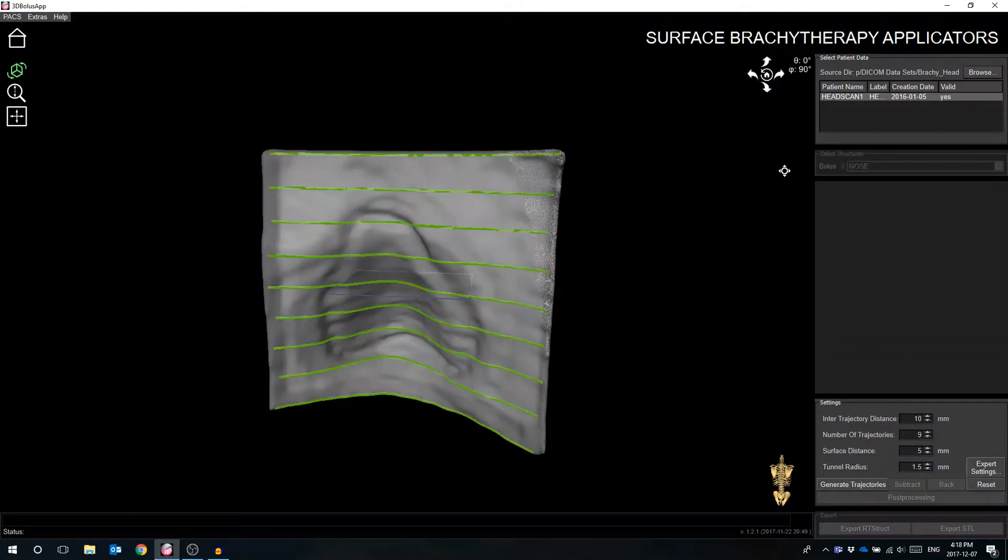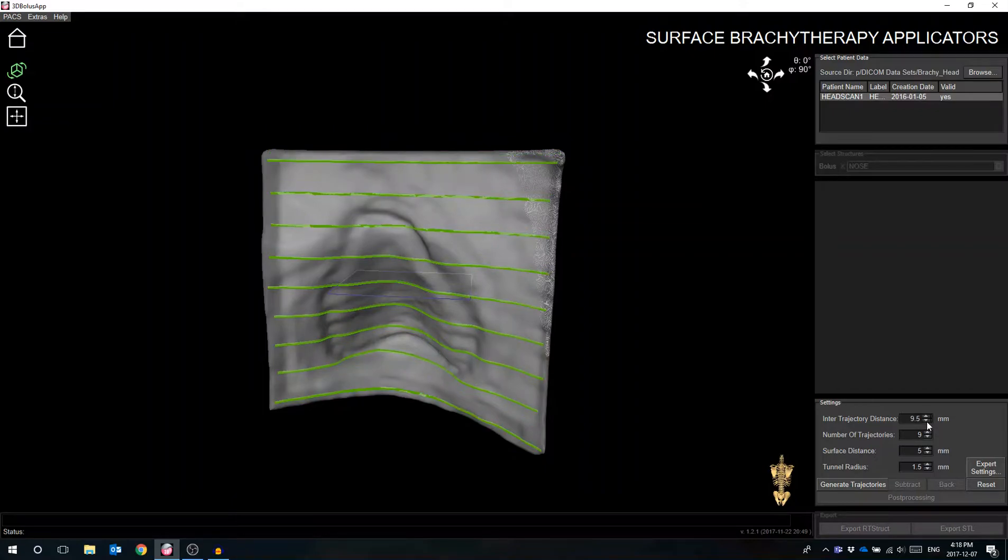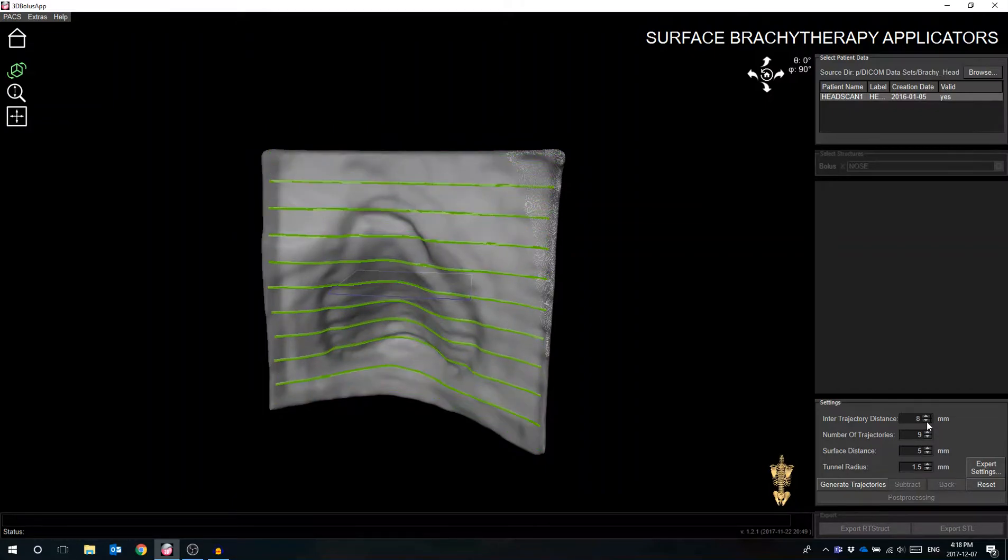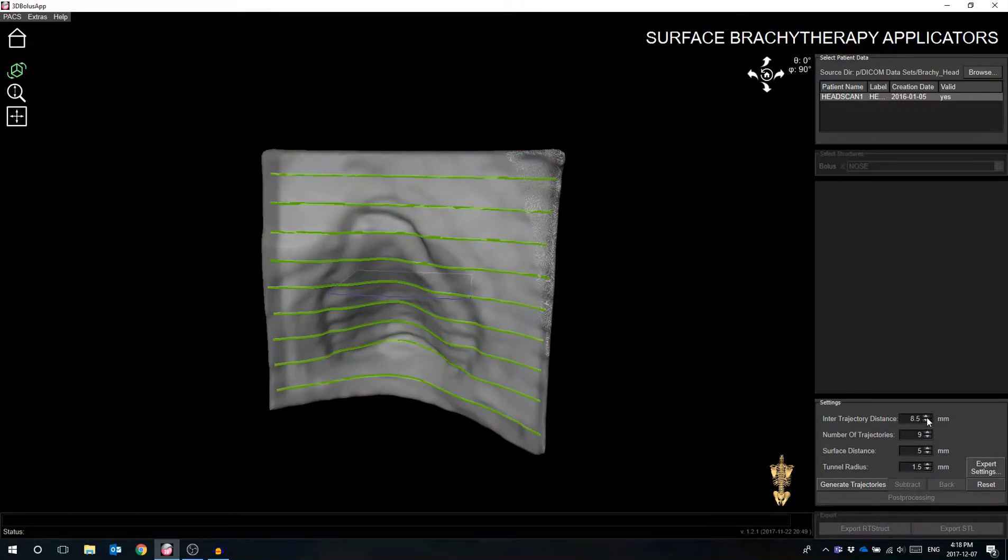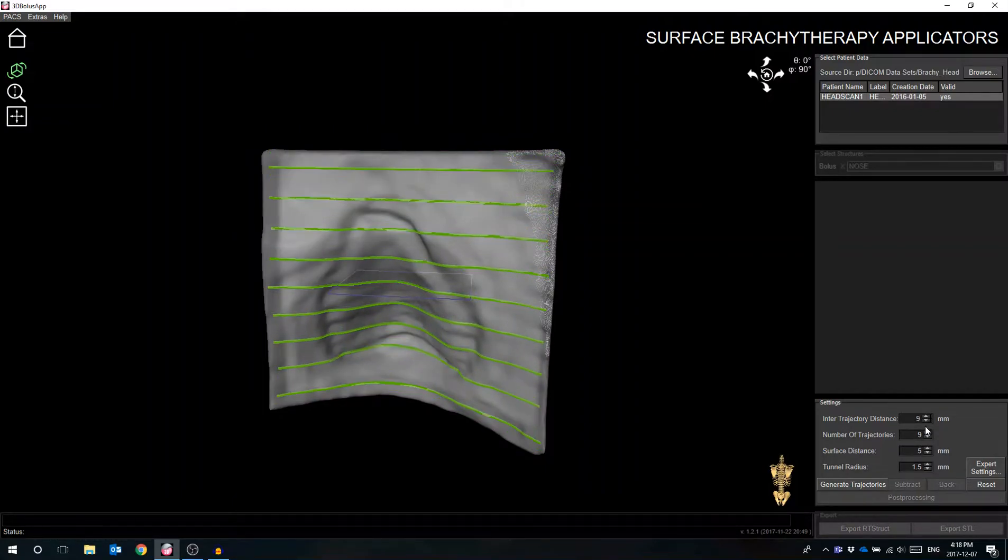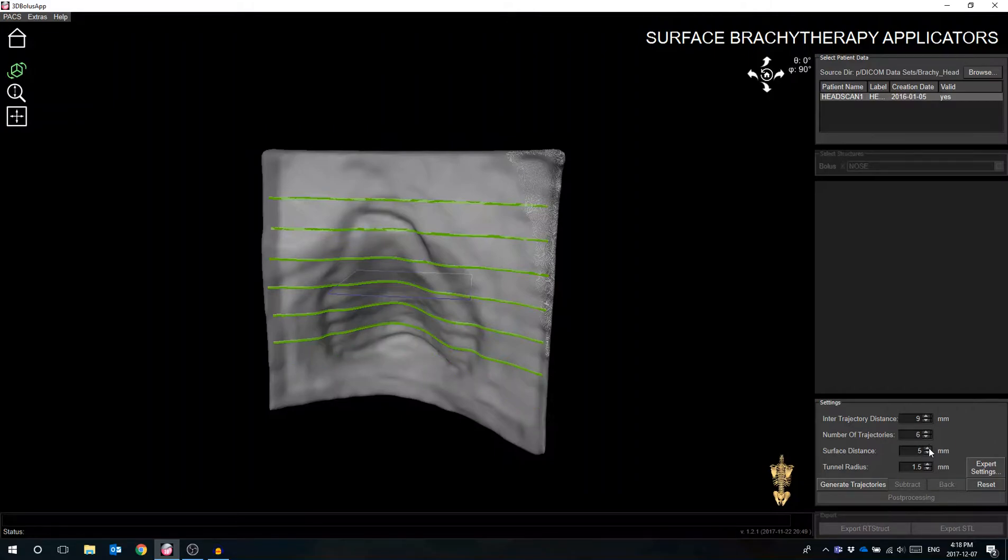Within this view, the user has access to additional customizable features such as adjusting the distance between each adjacent catheter, adding or subtracting the number of trajectories, setting the distance from trajectory to the patient surface, and determining the trajectory radius.